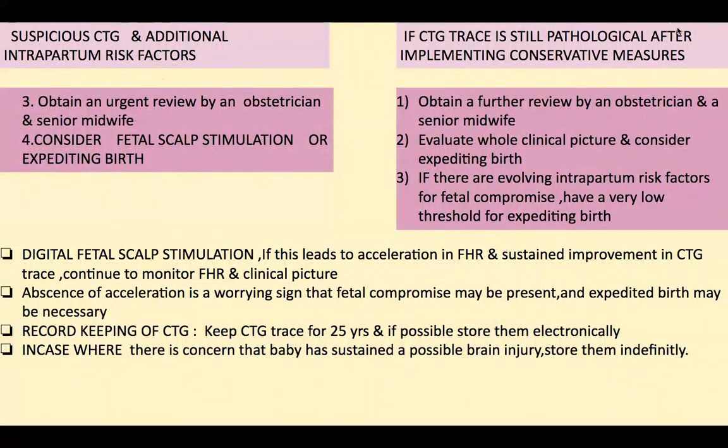If the CTG trace is still pathological after implementation of conservative measures, then what you have to do? Obtain a further review by the obstetrician and the senior midwife, evaluate the whole clinical picture and consider expediting the birth.